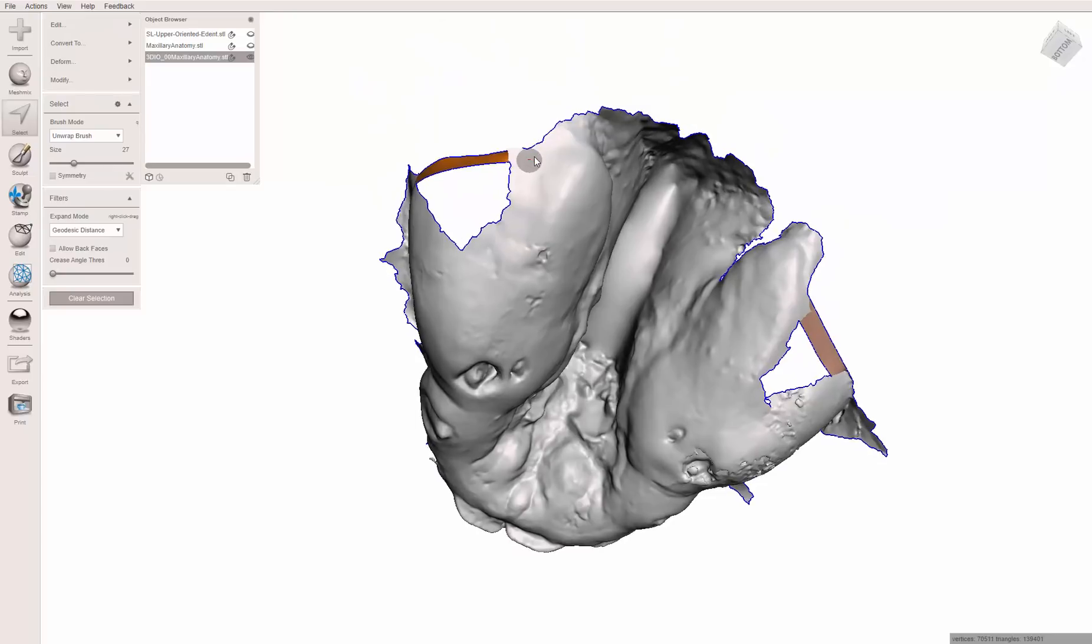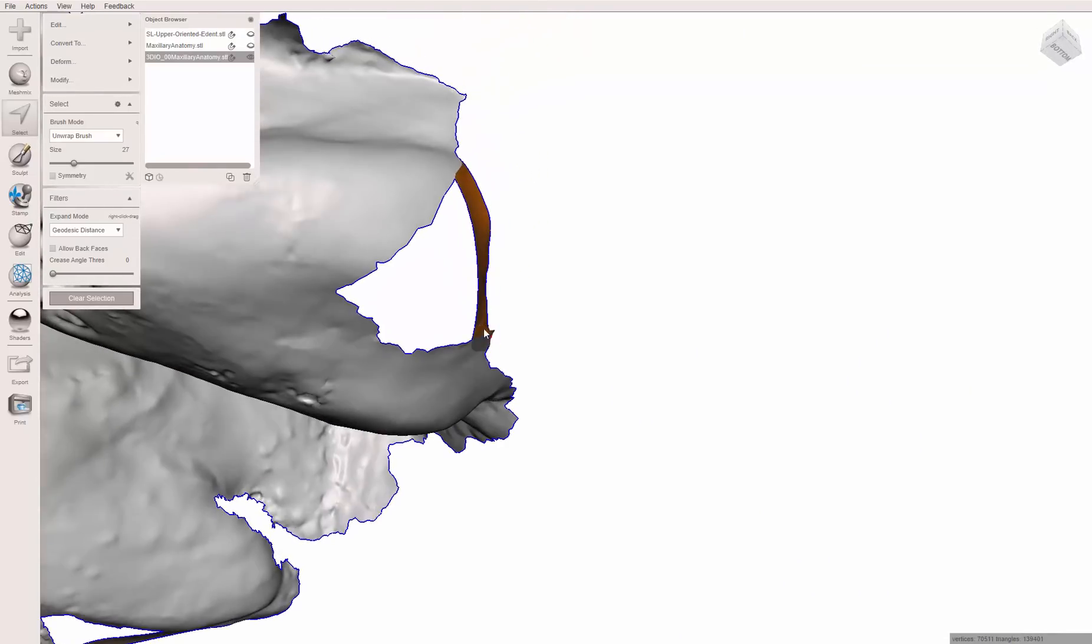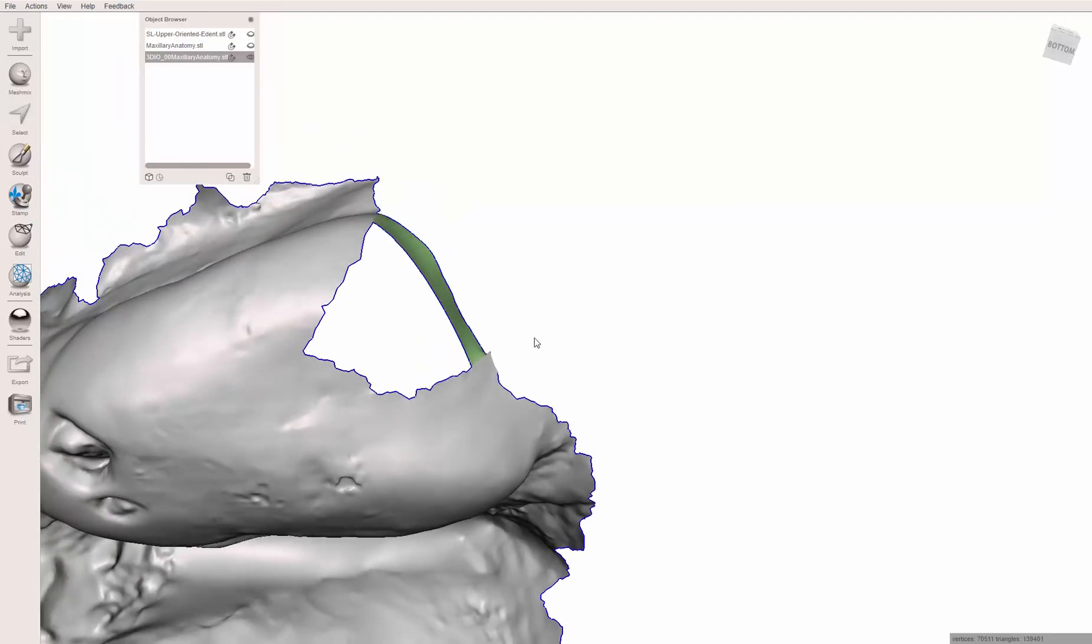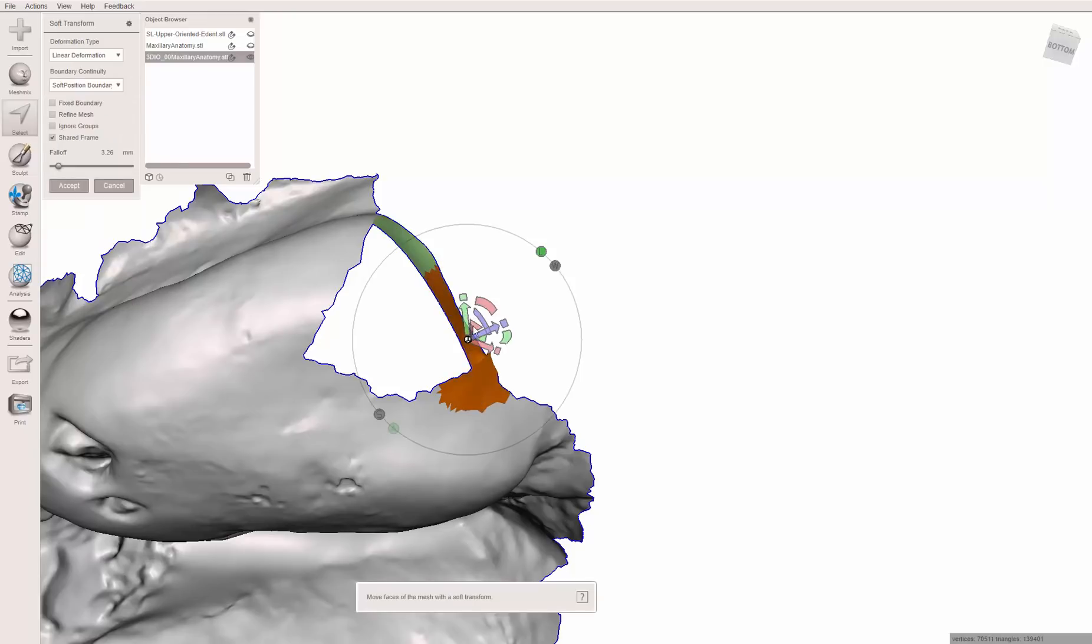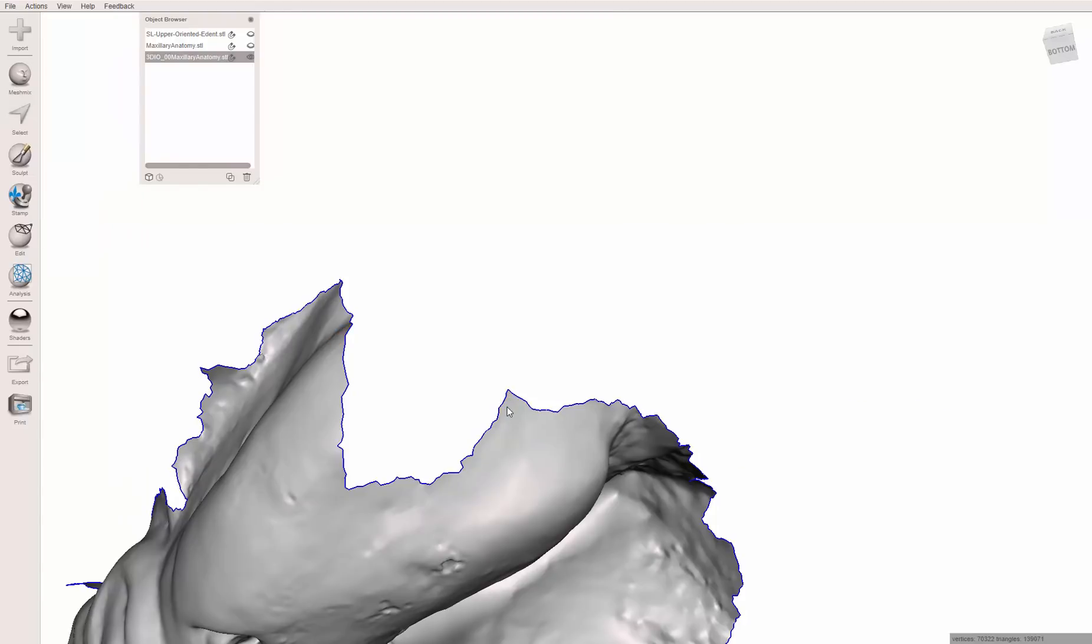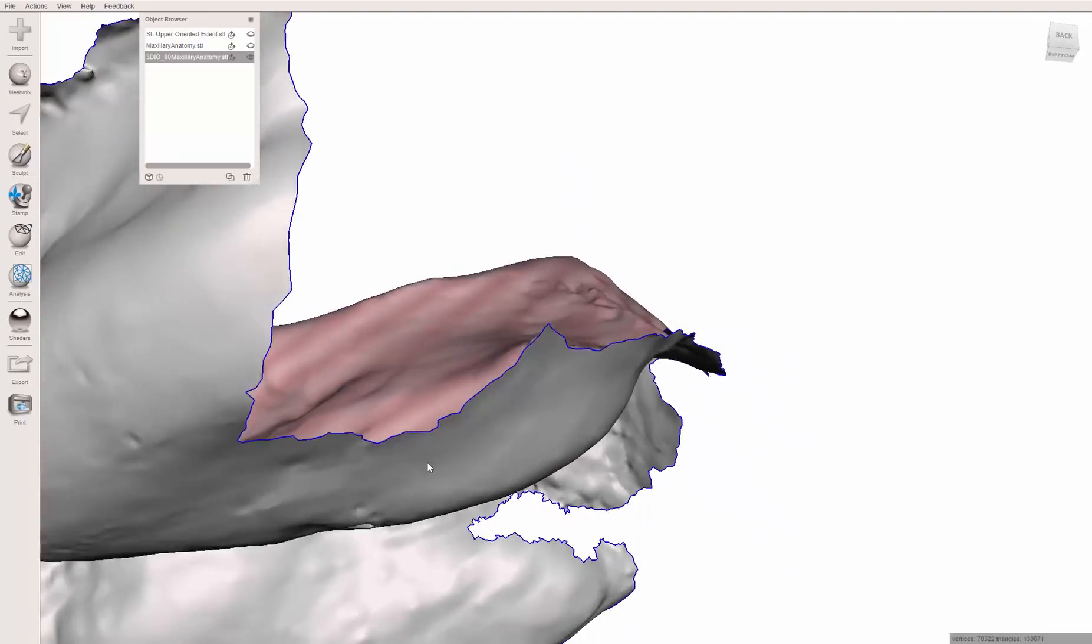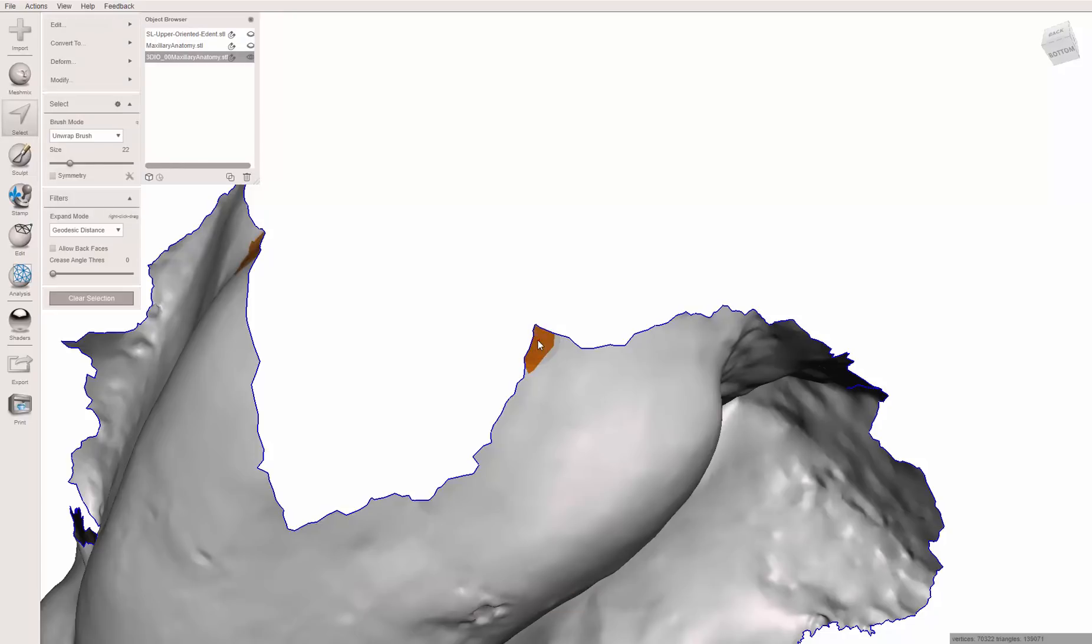And actually, I don't like this because it left a little spike sticking out here, which is positive data. And I do not want to underestimate that. Because anything I made after that would assume that it could fit over that. And that's not really true. So what I'm going to do instead, I could just redo the bridge. But I'm going to use the tool I already showed you. Shift T. No. OK. I am going to re-bridge this. I think the fact that I fell past this 90-degree turn is what really threw the computation off a little bit.